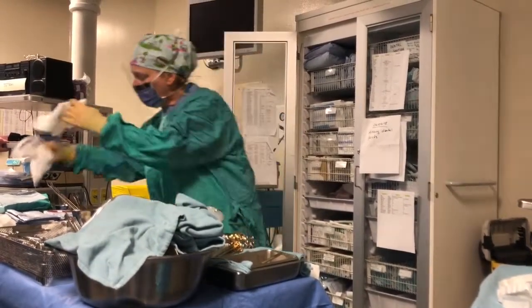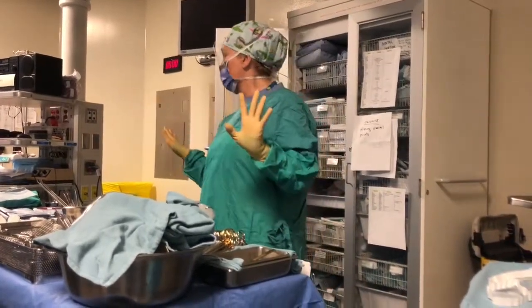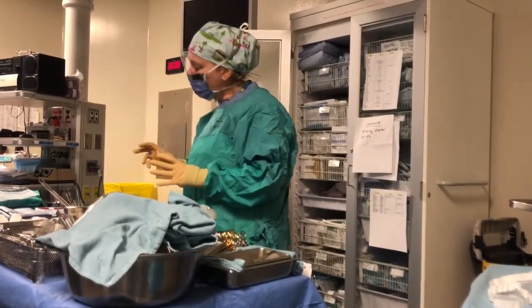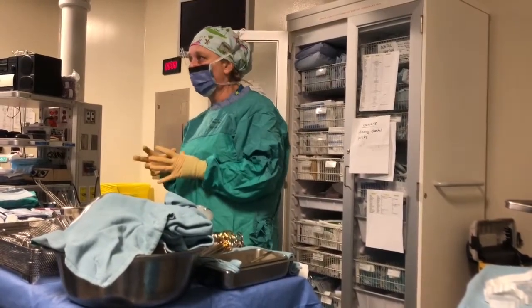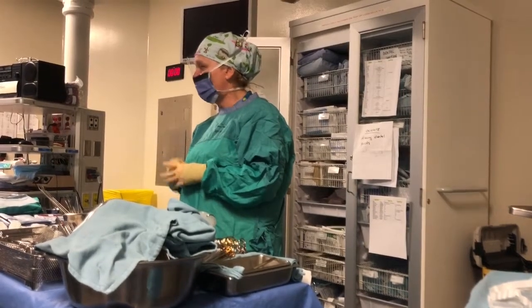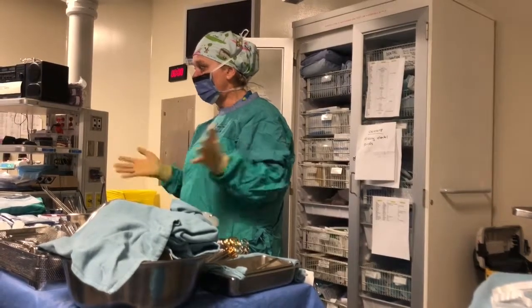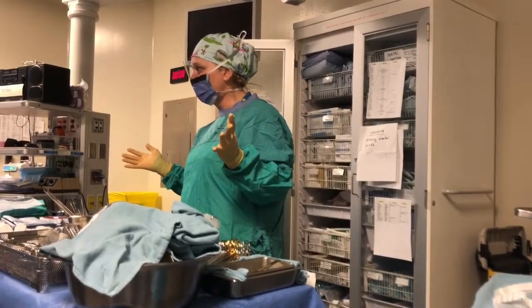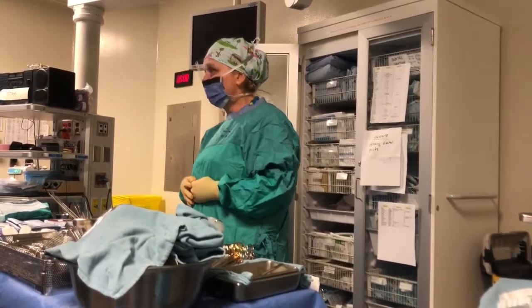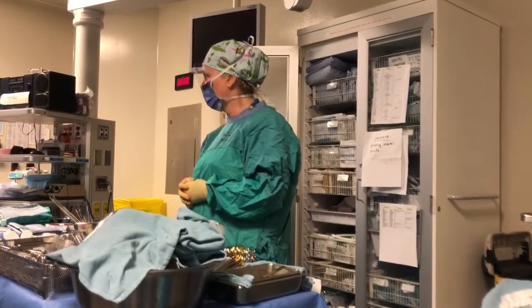Okay. So that's how we would count out. And we would tell the surgeon, okay, all your sponges are out. Because that's the biggest thing. Because some of them, when you're doing an aorta, are so soaked in blood, they can get wrapped underneath a bowel very easily. And you say, we're missing a sponge. Really? They start searching and they find it and pull it out. That's why, as soon as they're starting to close, we do a sponge count right away.